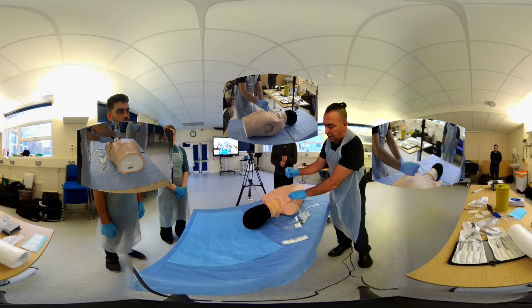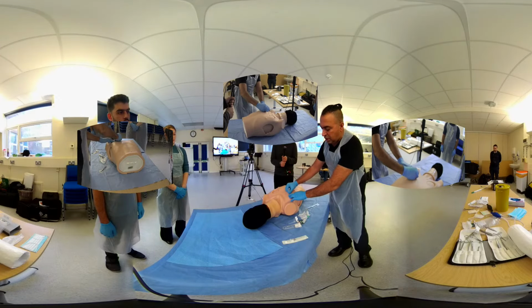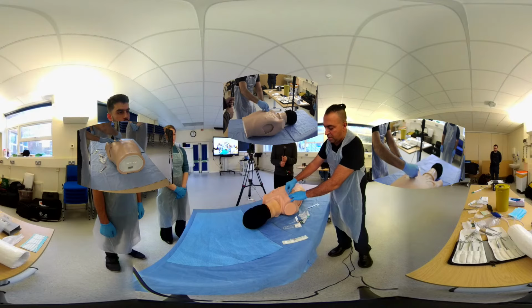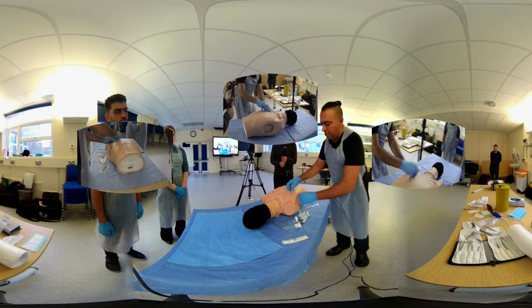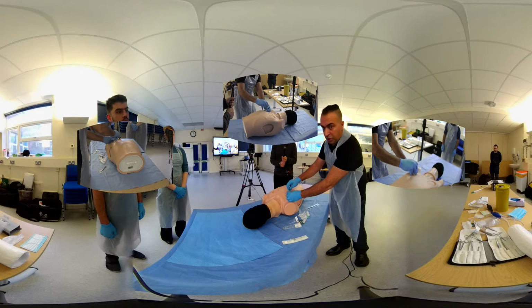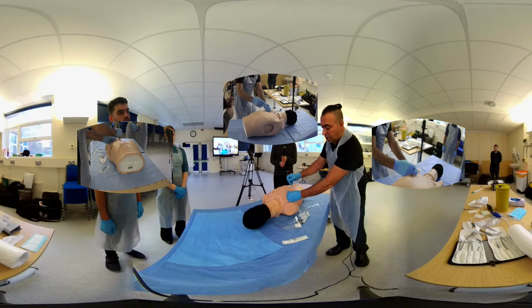So it's going directly perpendicular to the patient, so right down, and you're going just skirting above the rib and pushing it right down here. So it's got to go right down, it's got to go skirting above the rib, so that you're avoiding the neurovascular bundle which runs below the rib.